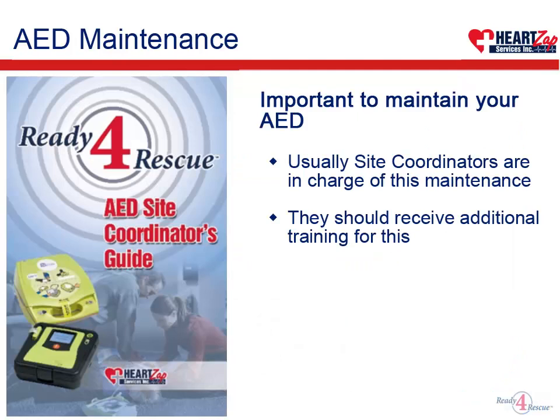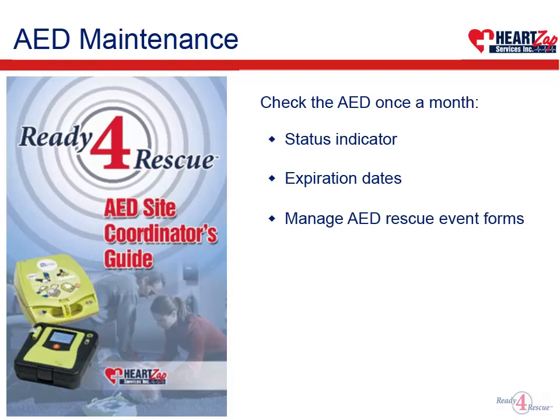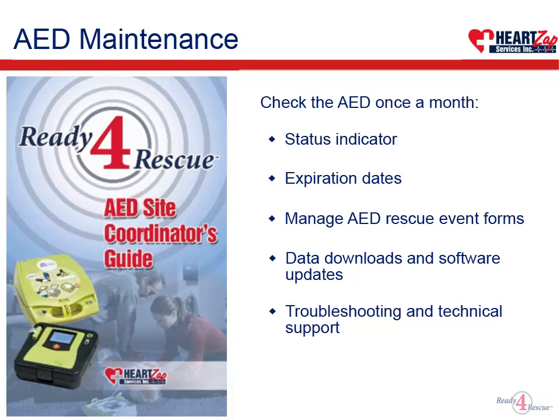It is important to maintain your AED. There are usually site coordinators that are in charge of this maintenance. They should receive additional training for this. It is recommended to check the AED once a month. At this time, the status indicator is checked, as is the expiration date for the batteries and electrodes. Maintenance also includes management of AED rescue event forms, data downloads and software updates, troubleshooting and technical support, and reordering of supplies.